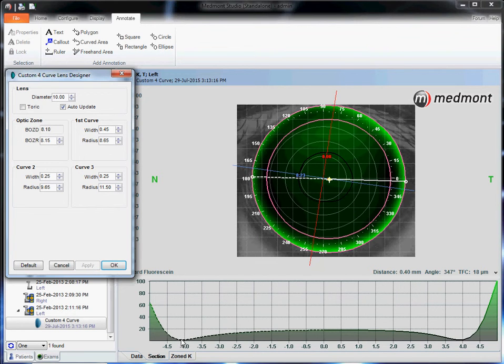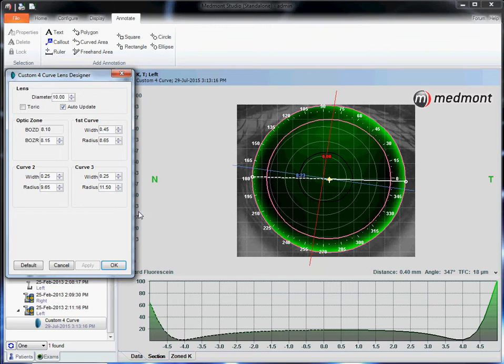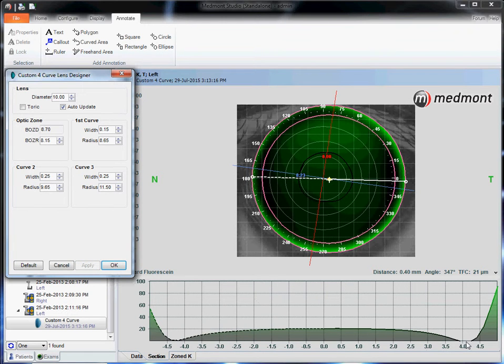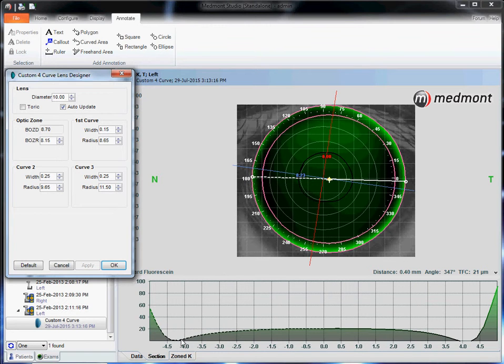We see that bearing point goes farther in, we get a slightly more shallow landing but a greater width of edge lift. If we were to go in the opposite direction, go much smaller, we see a more acute point of bearing with the peripheral cornea, a more aggressive angle as the contact lens comes back toward the surface.